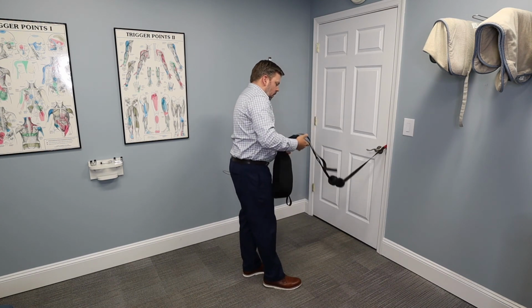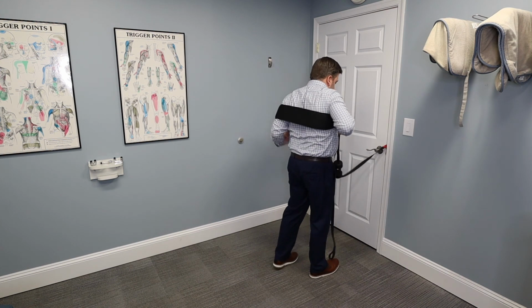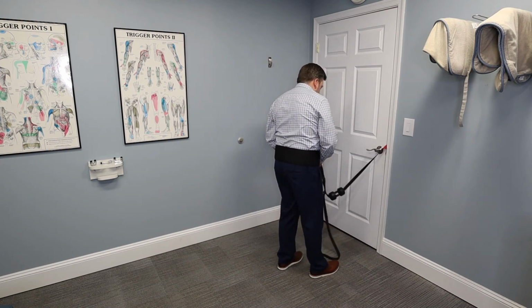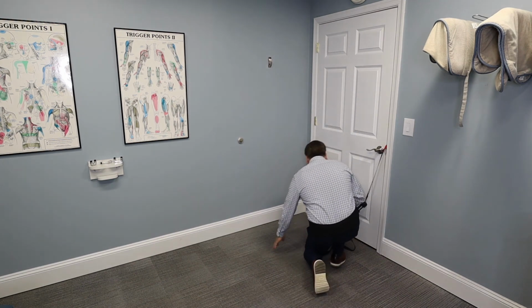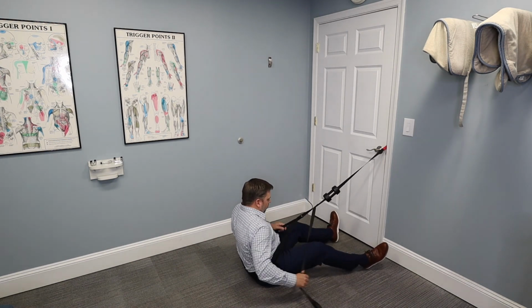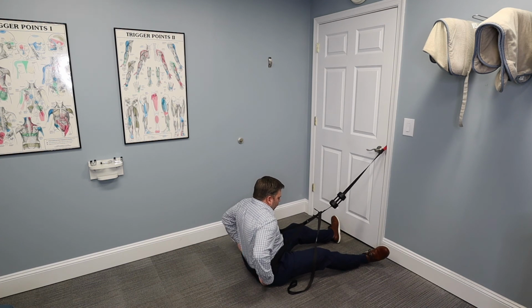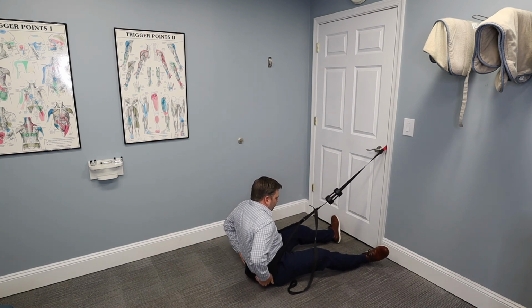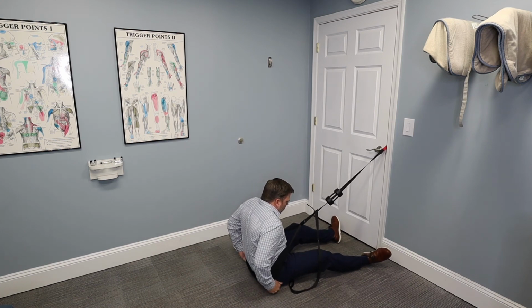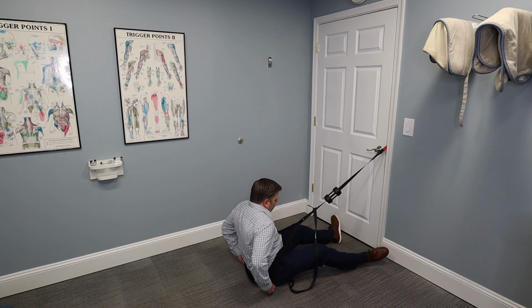The next thing we're going to do, I suggest doing this while you're standing up. Just put the unit over your head and roughly get it settled around your lower back and pelvis area. Then we're going to sit down. What we want is for the belt to be right around the belt line, in the lowest part of your lower back. We don't want it to be higher up, or especially high like that. Right around that belt line is a good starting point where you can figure that out.